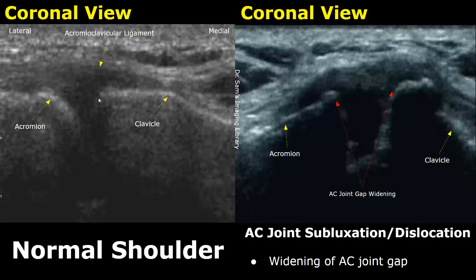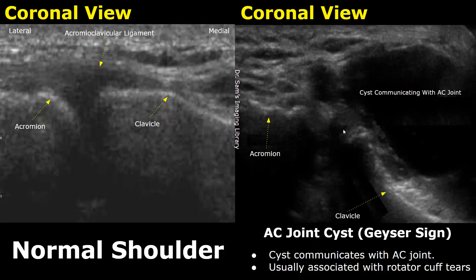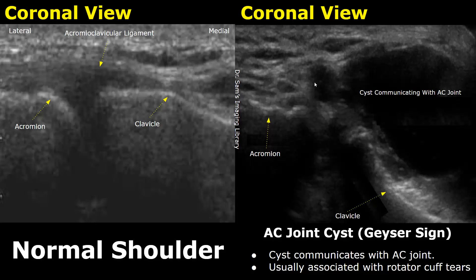This is a case of an AC joint cyst. The cyst usually communicates with the acromioclavicular joint, and this type of appearance is known as the geyser sign. Usually this AC joint cyst is associated with rotator cuff tears.